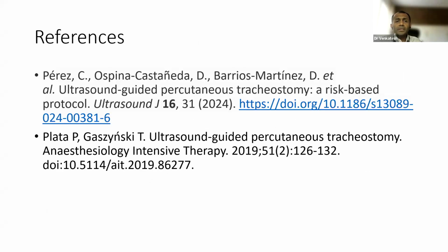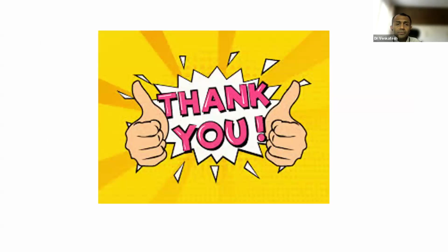It is easy. We always do percutaneous tracheostomy on the bedside with the help of ultrasound. Very rarely we have used bronchoscopy. Probably in previous tracheostomies is where we have considered using bronchoscopic guidance. But otherwise, even in previous tracheostomy, if it is not complicated, then the redo, short neck patients, there are studies which have shown the benefits of ultrasound guided tracheostomy in all such populations.